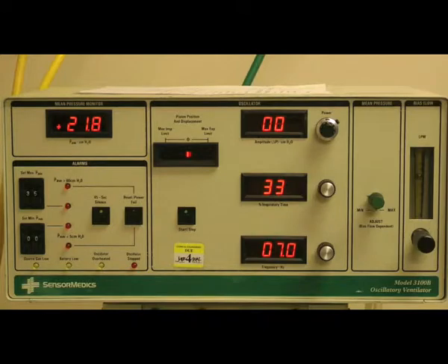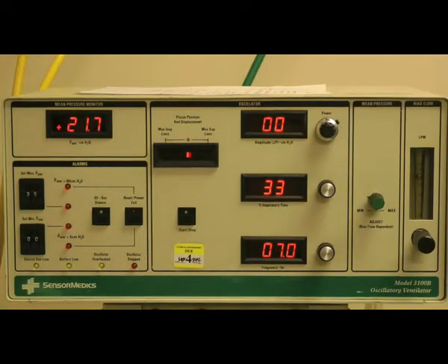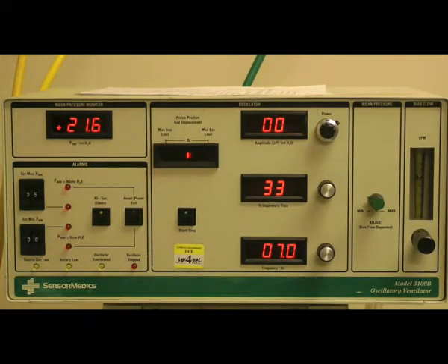It is also important to consider the contraindications for high-frequency ventilation. These include known severe airflow obstruction and intracranial hypertension.